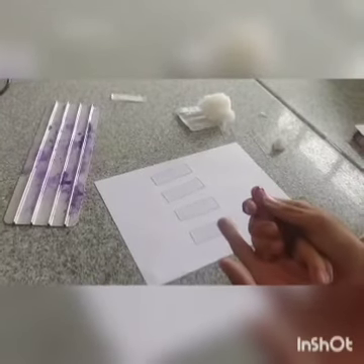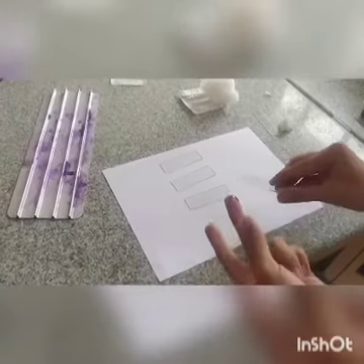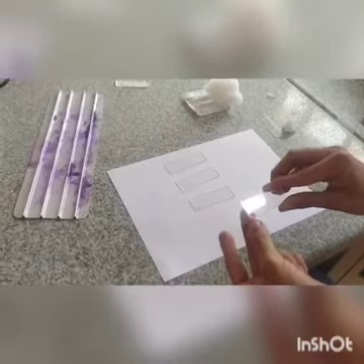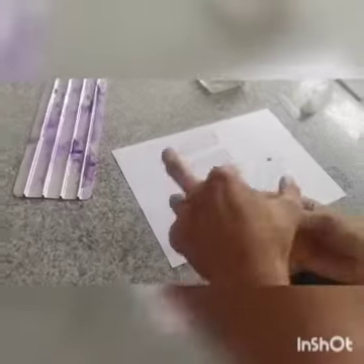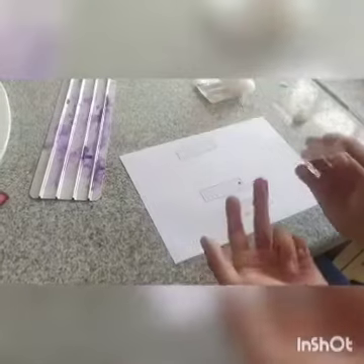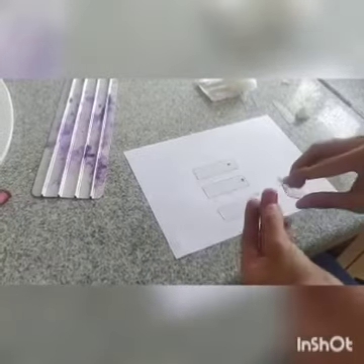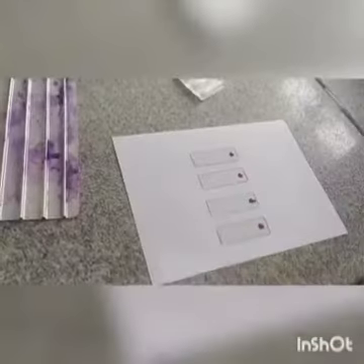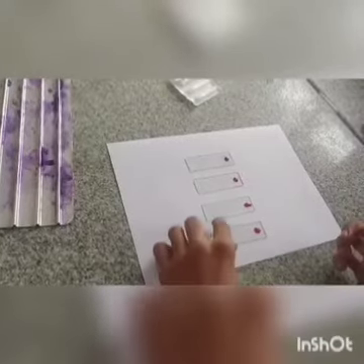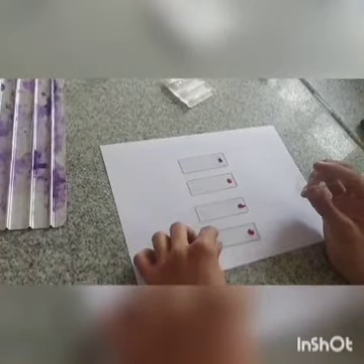Now lift a slide with your other hand, holding it along its long edges, and touch the top of the blood on the down surface about 1 centimeter from its narrow end. The drop to the right side. Hold the left end of the slide with the thumb and the finger of your left hand. Now grab the long edges of the spreader between the thumb and the finger of your right hand.